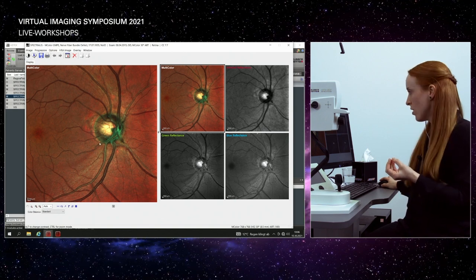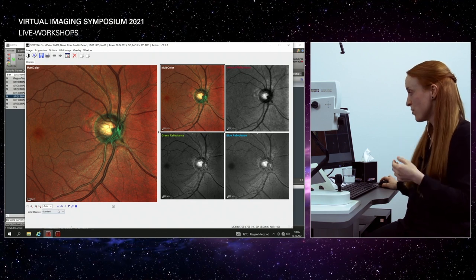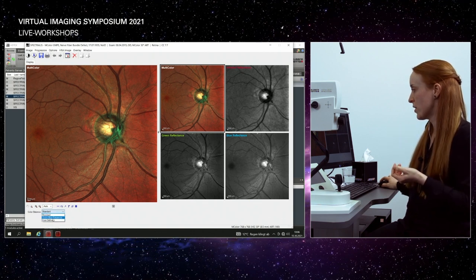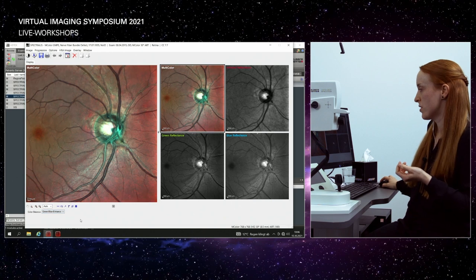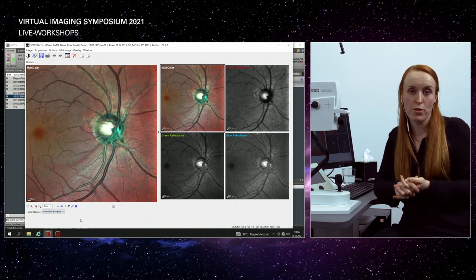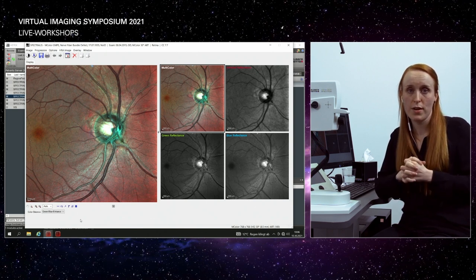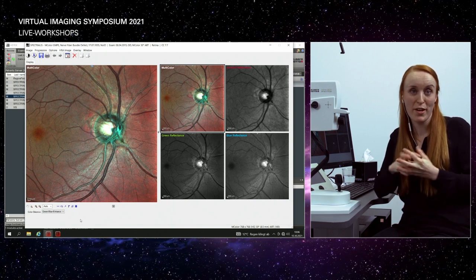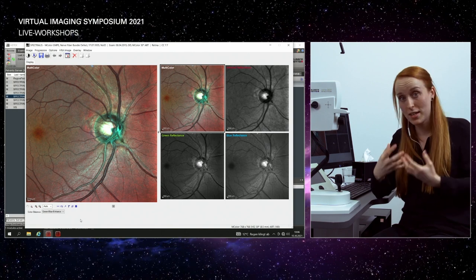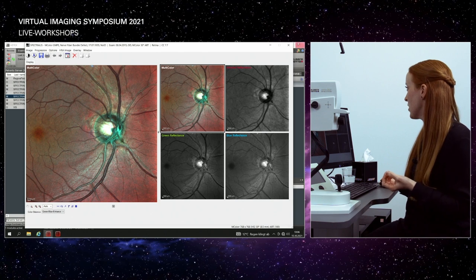So if you're expecting to have something on the surface, in the superficial layers of the retina, just try the green-blue enhanced color balance to have more information on that. We have this color-coded image, and you can play around with that, okay? And it can help you to find some special things in this.